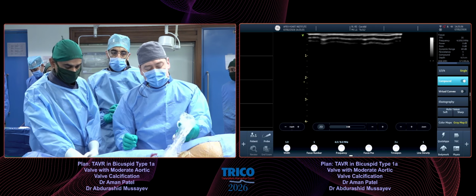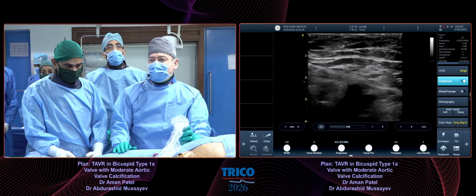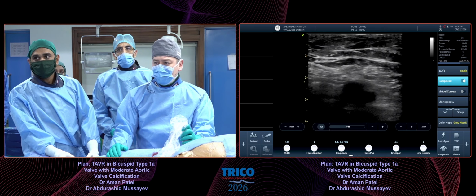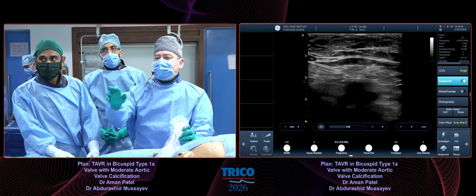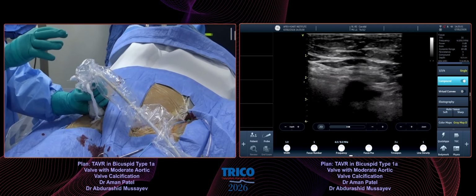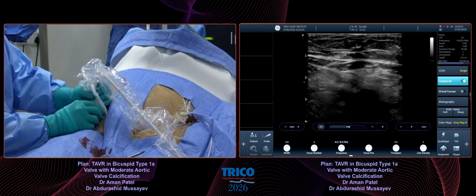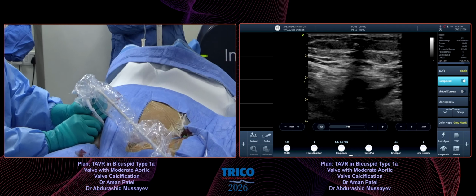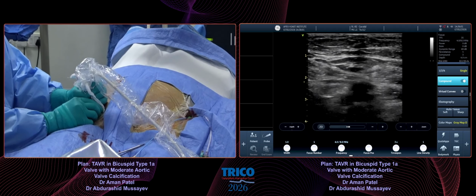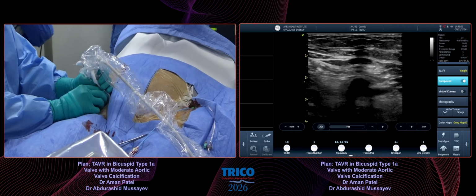And let's go to the short axis. In short axis you can also see the right side femoral vein. When I compress, this femoral vein is compressed, you see. When I go up, this is the common femoral, and when I go down, this is the bifurcation.